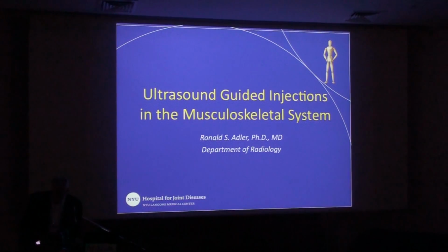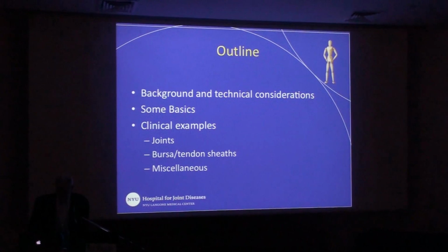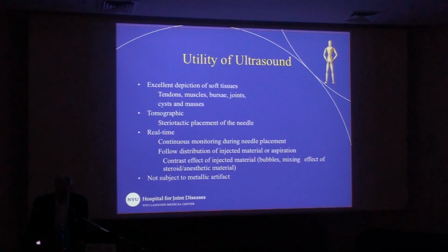Everybody hear me okay? So for the next 30 minutes or so, we'll talk about ultrasound-guided interventions in the musculoskeletal system, a little bit about some background, some key technical considerations. We'll review what musculoskeletal tissues look like on ultrasound, and then we'll go through a series of clinical examples.